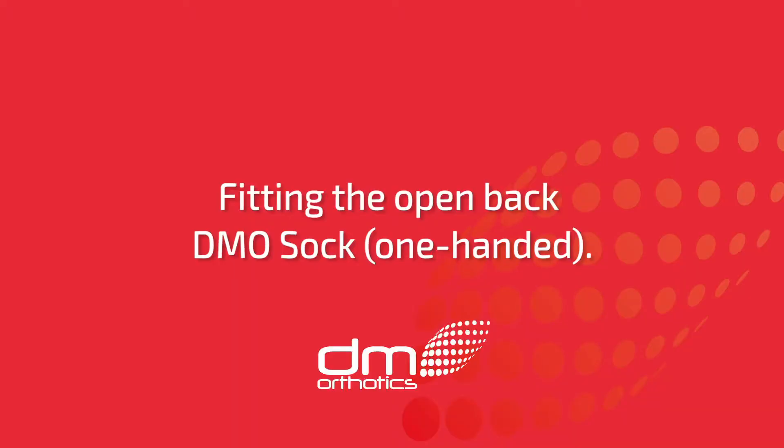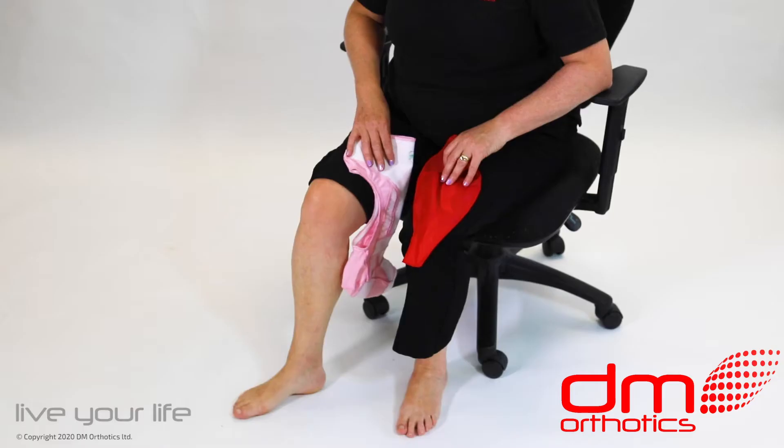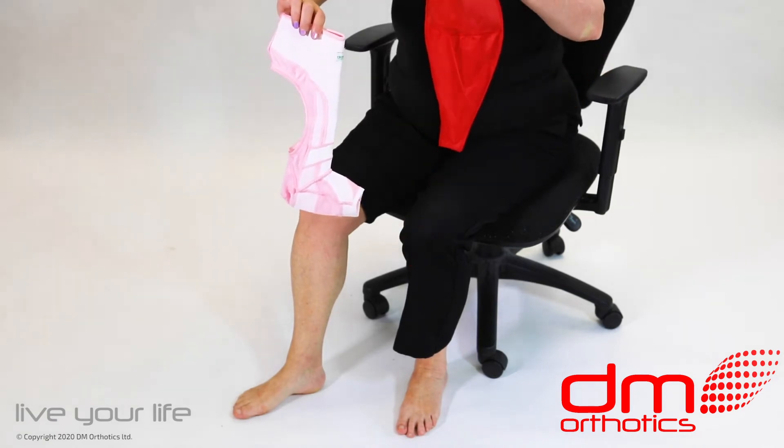Fitting the open back DMO sock one-handed. Remove the sock and the silk applicator from its packaging.